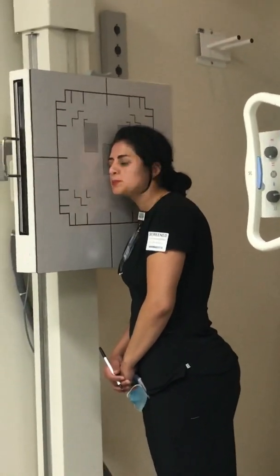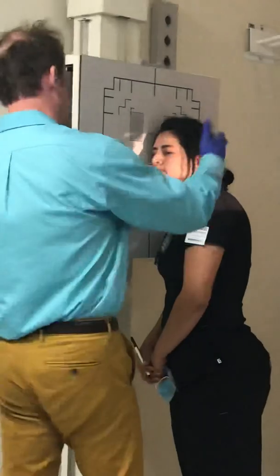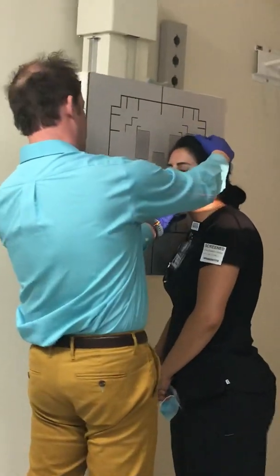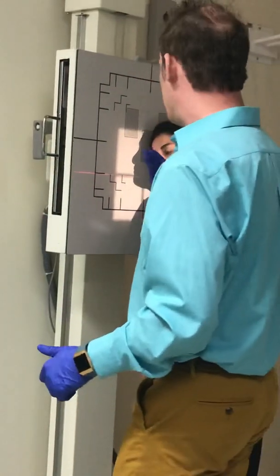Angle the head. So what we're going to do is — she's already in a true lateral — I'm going to have her step to her side just a little bit and tilt the head in 15 degrees. So that's really important.